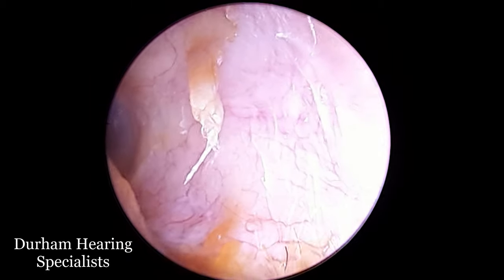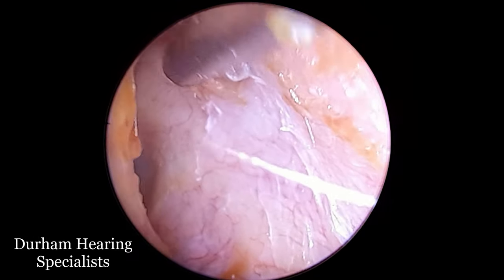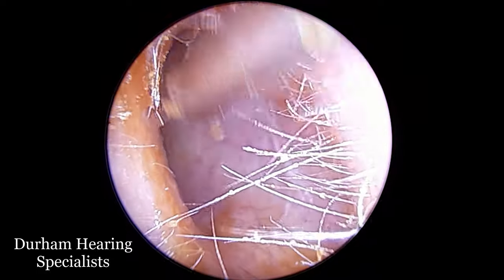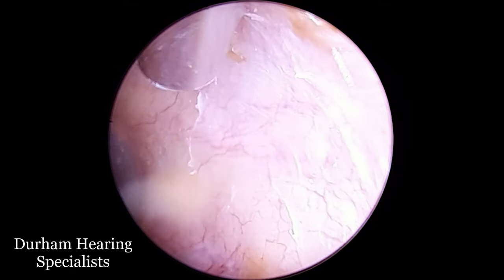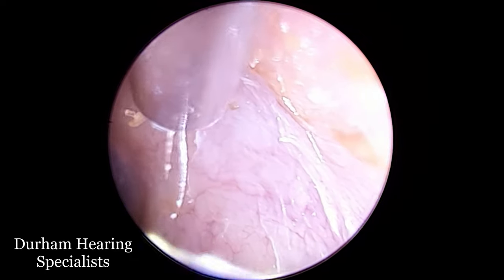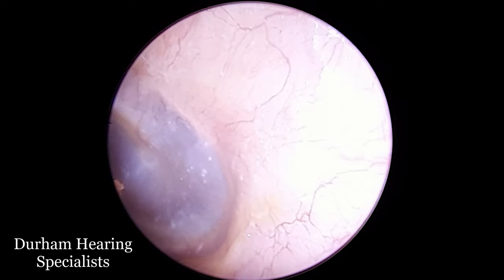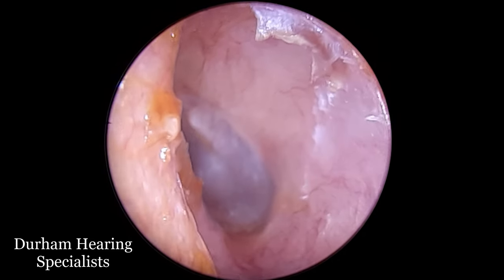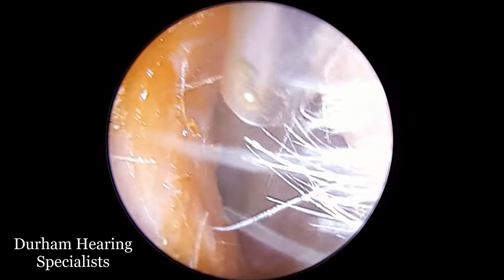The reason for that is that if the patient gets water in their ear, most of the time they'll be absolutely fine, but soggy dead skin in a warm environment is a perfect breeding ground for microorganisms. Some of those microorganisms may lead to a bacterial infection — what we call otitis externa. It's impossible to remove all of the dead skin and we certainly don't want to be lingering in the ear canal too long with a suction probe, but overall you can see here this grey skin is the eardrum, which looks fairly good. We've got a fairly clear ear canal, so this is a good outcome for the patient with no concerns of a clinical nature.